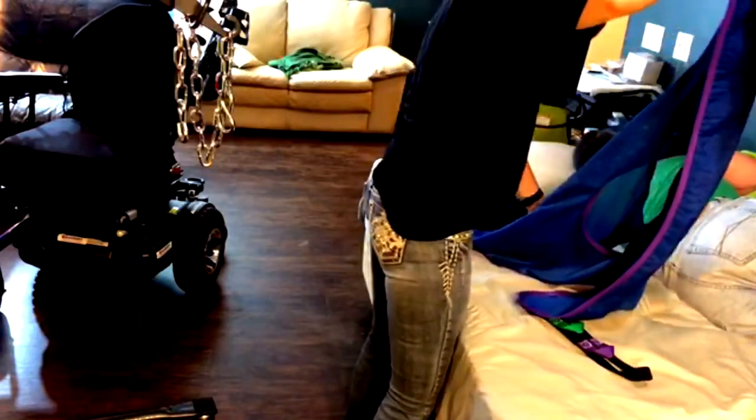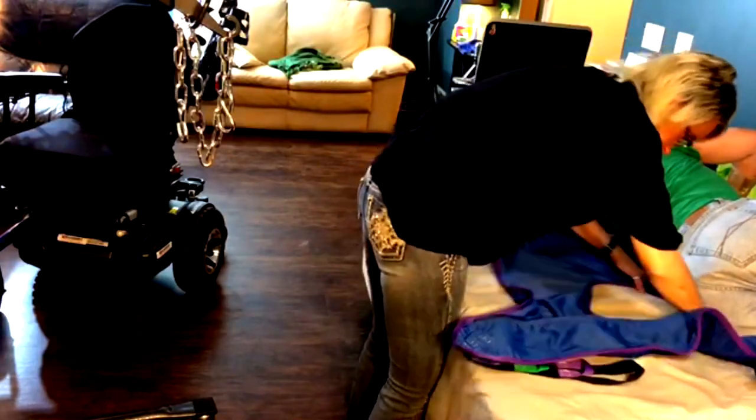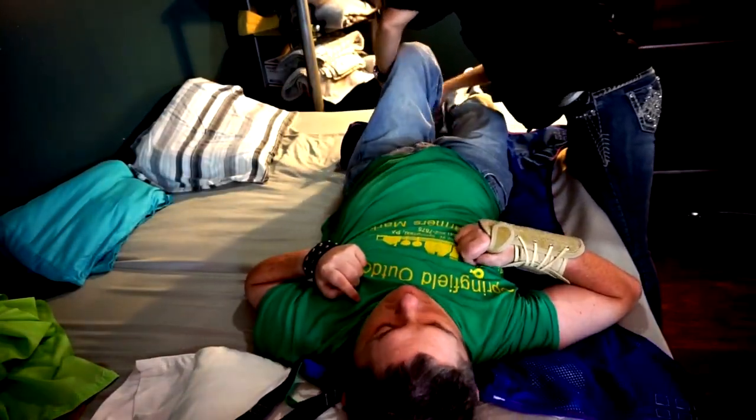I roll up on my side so I can tuck the sling in the back, and I always put the butt hole over my backside — well, that doesn't sound weird — give it a good tuck in. I try not to put it too far up past my shoulders that way the Hoyer stays around my knees.